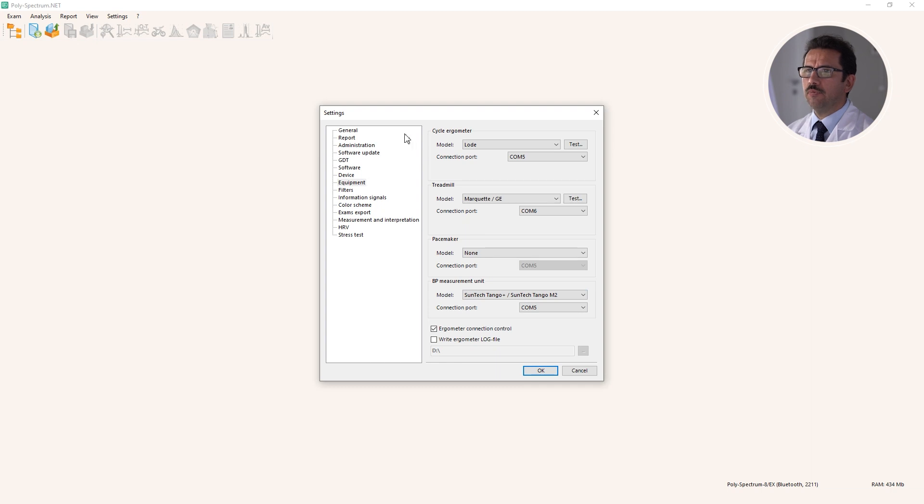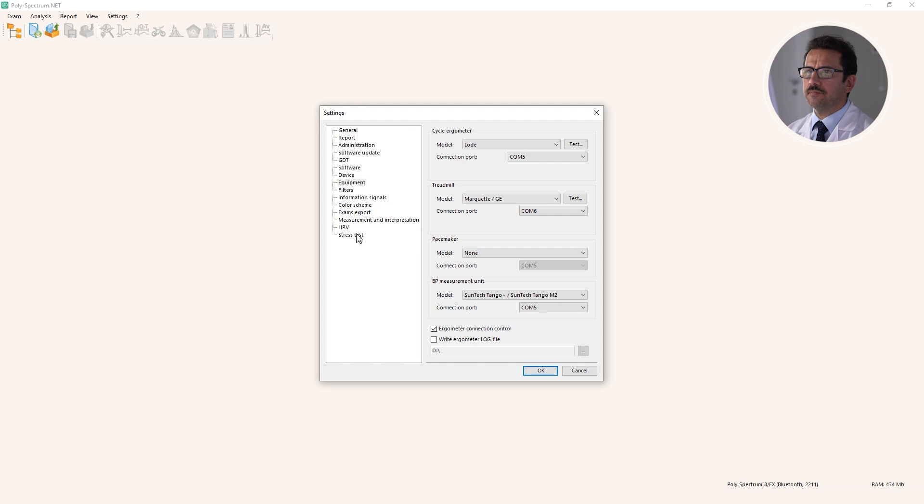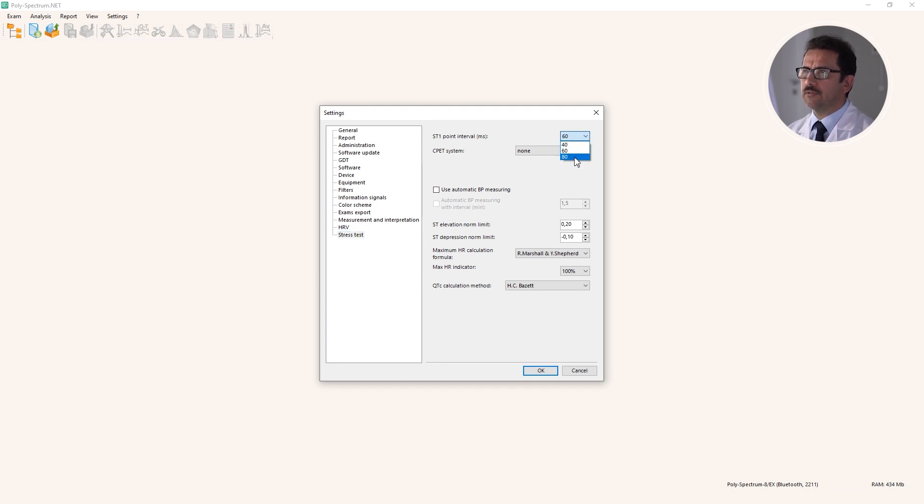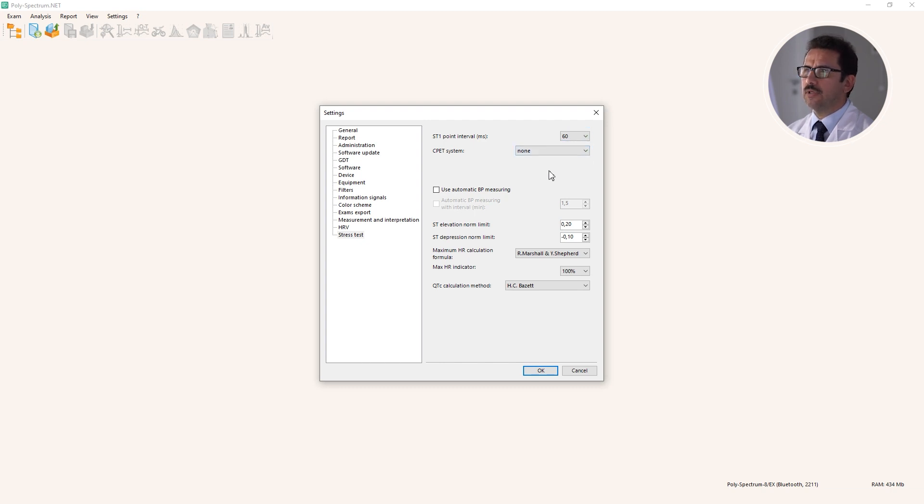Next point that we should check is the stress test line. What's important here is ST1 or J plus point interval. By default it's set to 60 milliseconds, but you can select 80 milliseconds or 40 milliseconds depending on your local guidelines or current guidelines. If you use an automatic blood pressure measurement device, you need to check here.